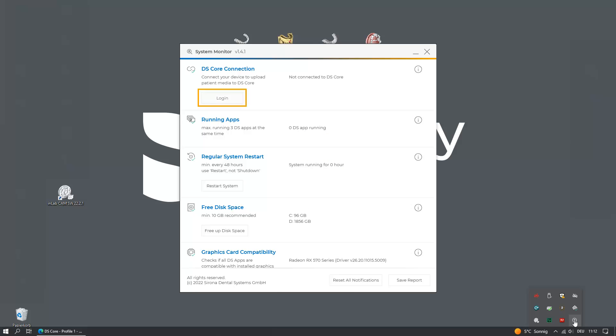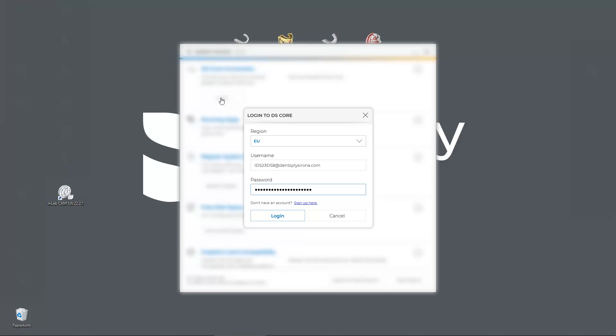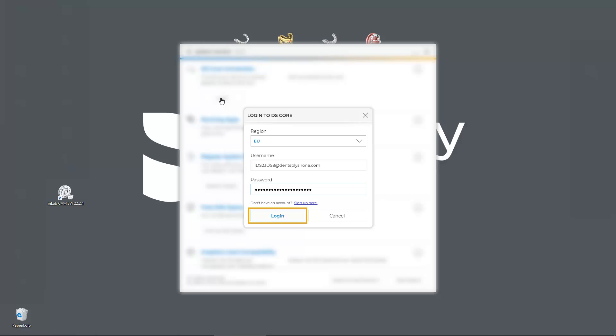By tapping Login, a new window opens. We first choose the region where our practice is located. Enter our DSCore account username and password, and confirm with Login.